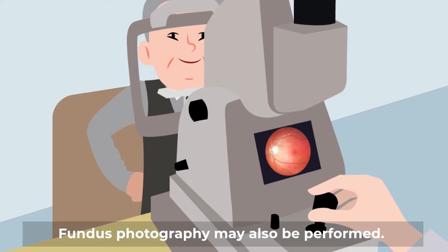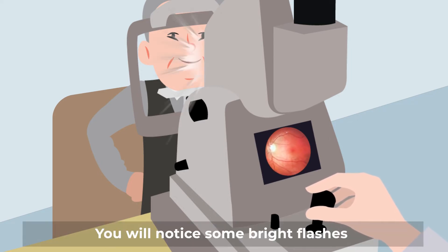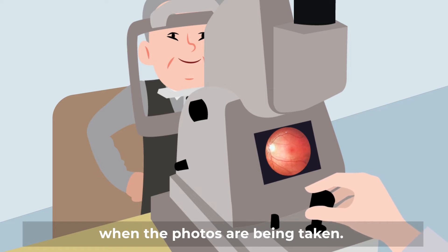Fundus photography may also be performed. This involves taking a digital photo of the retina with a camera. You will notice some bright flashes when the photos are being taken.